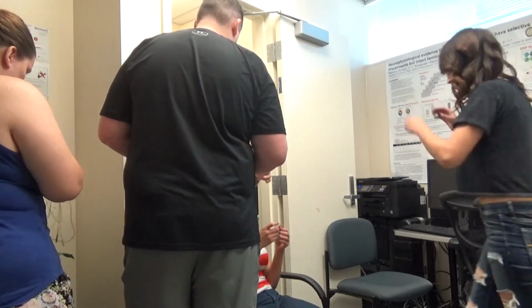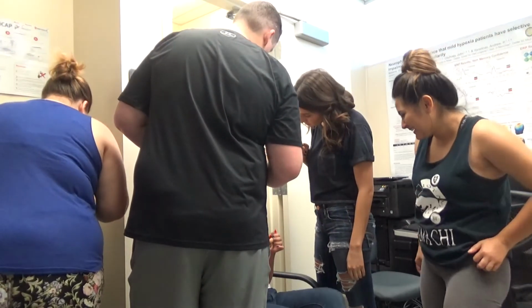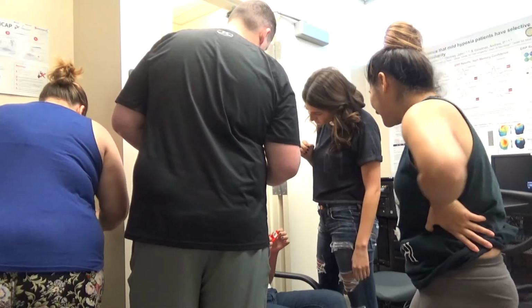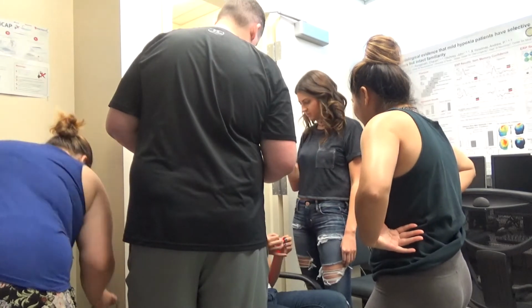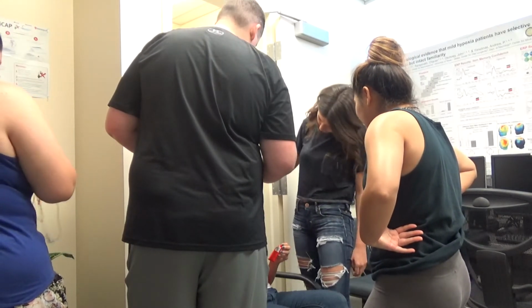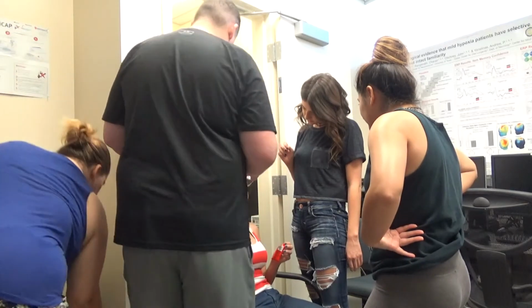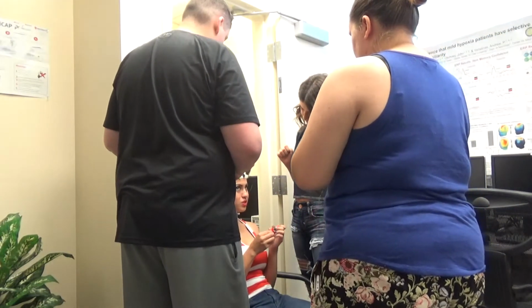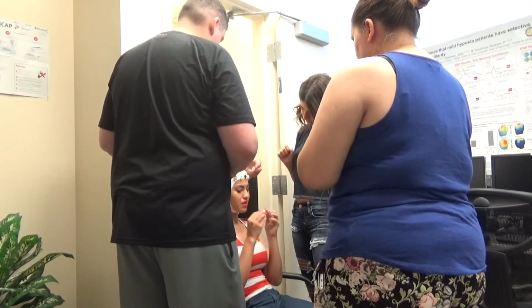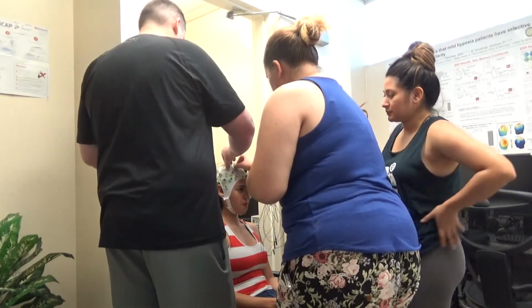So a couple other people want to help take these electrodes out. So all you're gonna do is you put your nail kind of in the middle. You just pry it out. It just kind of pops out. I just wedge my nail in like that, and then you can just pull them out pretty quick. But the most important part is you're gonna handle the electrodes by these gray plastic ends. Don't handle it by the wire. As long as you do that, you're basically fine. And that's it. You pull them out and hold them.